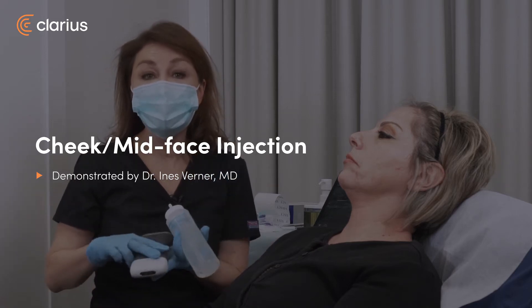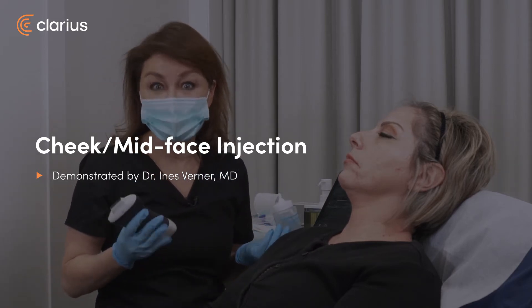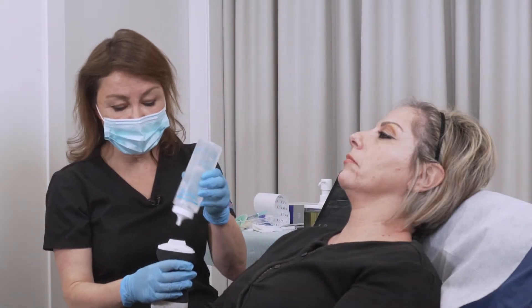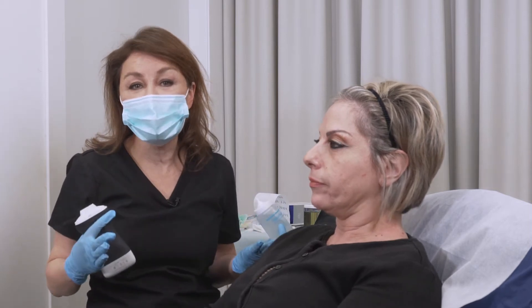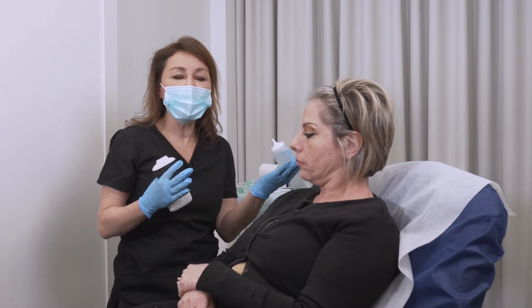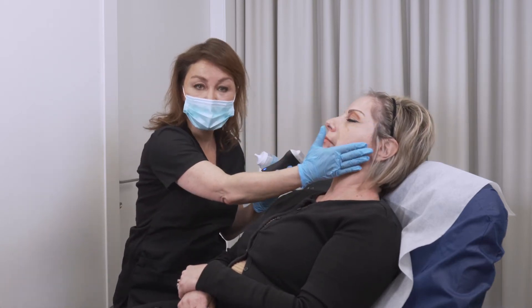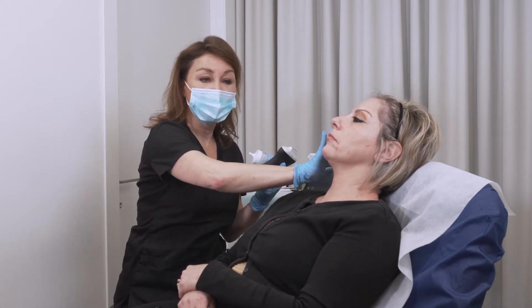We are now going to inject the cheek — the mid-face. The mid-face is a very important area to inject and to improve the form of the face and how we look in many cases. In her case, we can inject both the lateral parts of her cheek and also the medial parts of the cheeks.